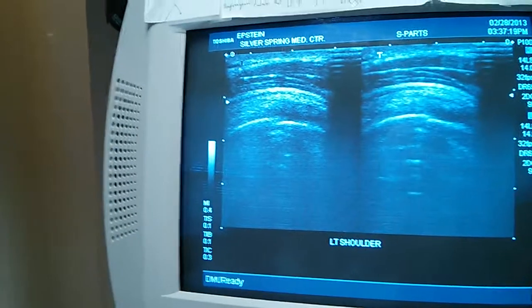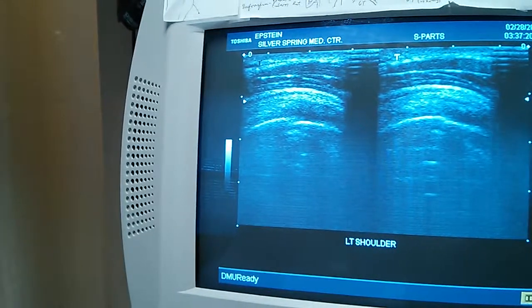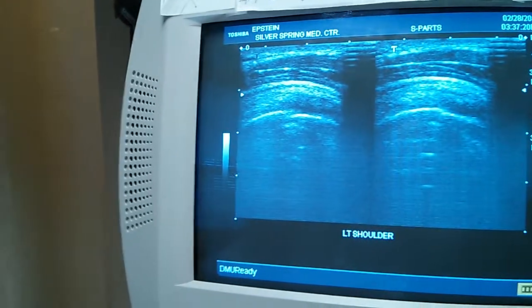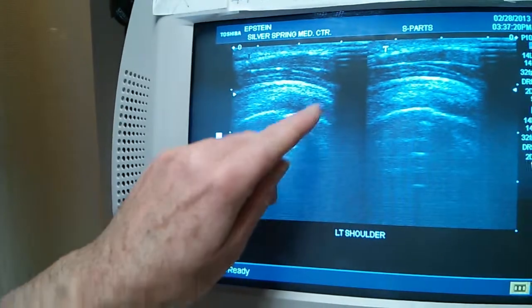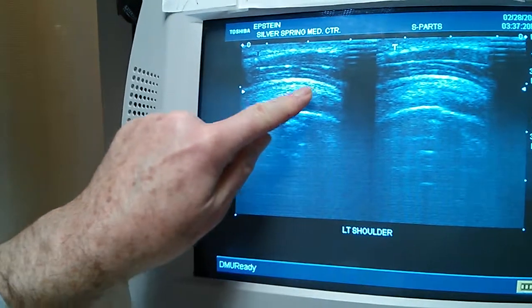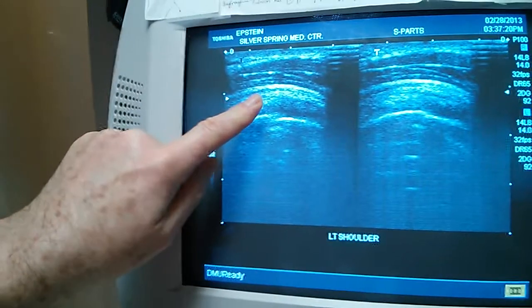So what do you do with bursitis? We treat it with physical therapy. You did that already. And then if it doesn't get better, we can give you a cortisone shot, which I can do using the ultrasound. Actually, you watch the needle going right into the space. Oh, we should totally do that next time. That'd be great content.